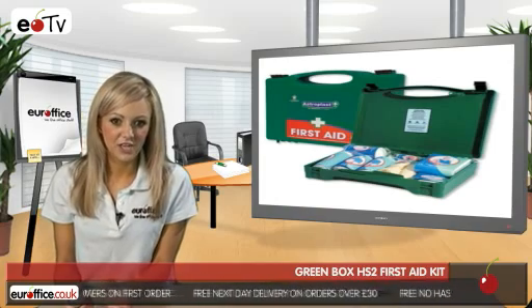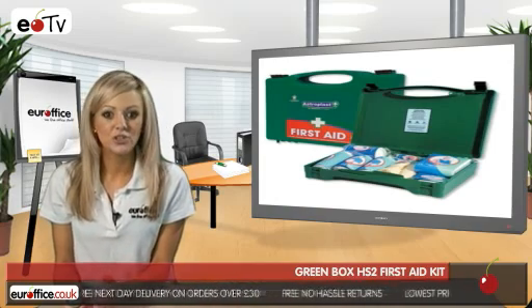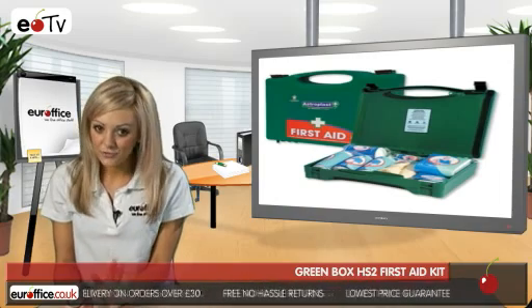One of the most important things you get with the Green Box First Aid Kit is a First Aid Guidance Leaflet, which makes sure you're not doing the injured person any further damage.